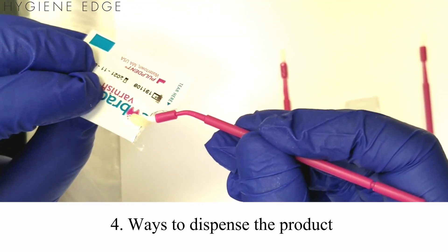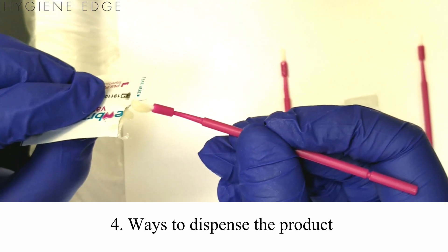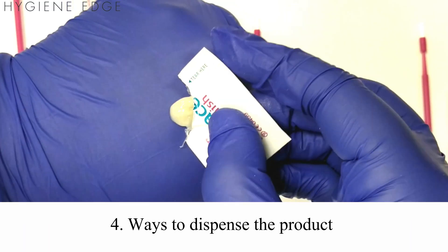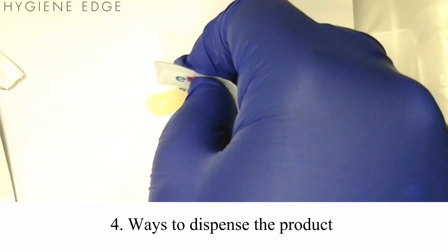To dispense the product, you can squeeze a small amount right from the edge of the container, or make the container into a cup to dip the brush into. You can also dispense the varnish onto your glove or directly onto a tray or pad.